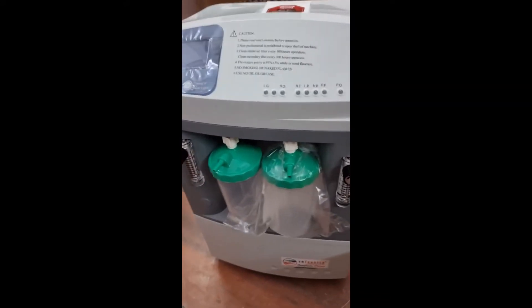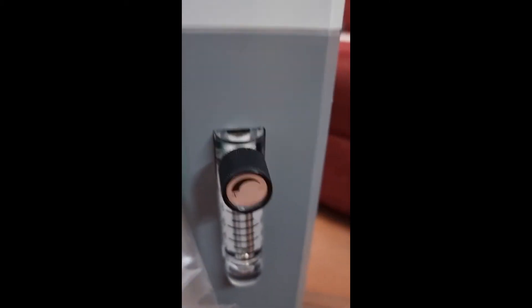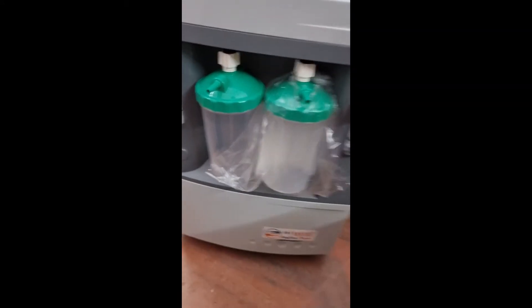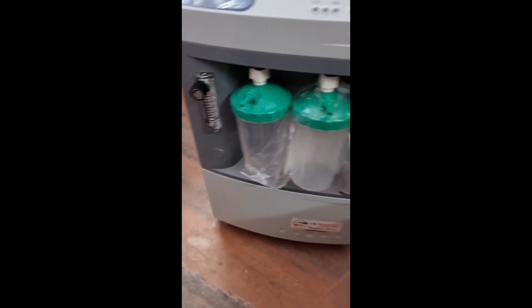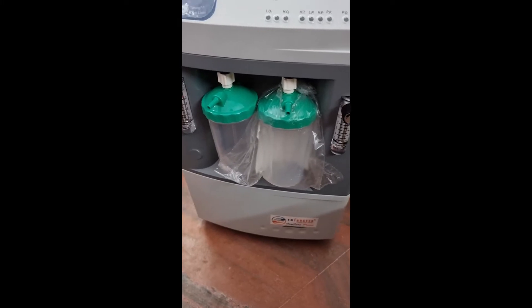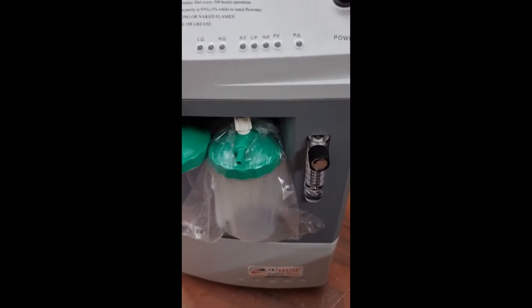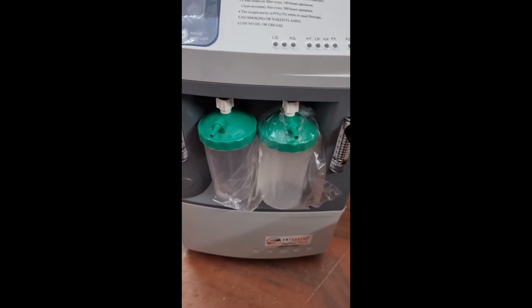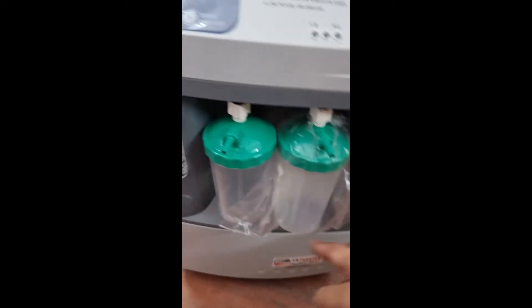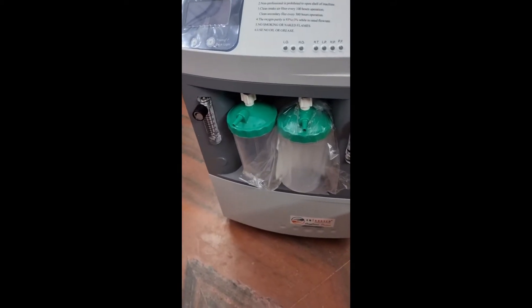First, let me show you a small walkthrough of the product. You can see two flow meters and two humidifier bottles — it is a dual flow model. Each flow meter can be adjusted from 1 to 10. You can use the left bottle for a single output of 10 liters, or the right bottle for 10 liters, or use dual flow simultaneously. The total combined output is capped at 10 — for example, 8 and 2, or 5 and 5, or 3 and 7. The maximum combined output should be 10.